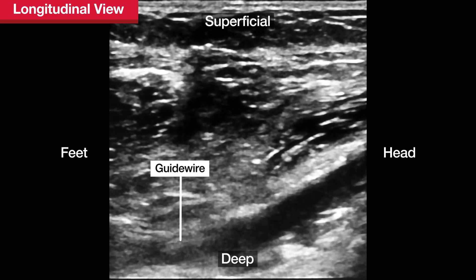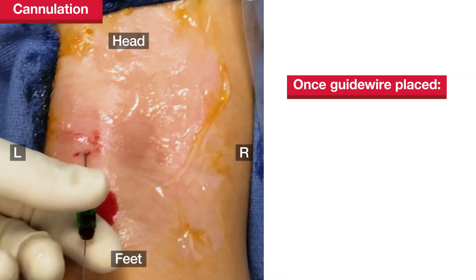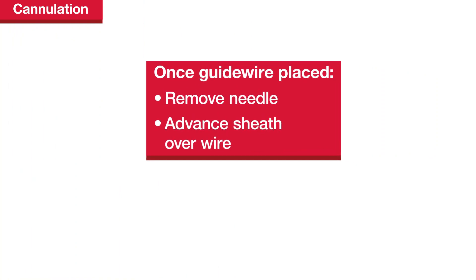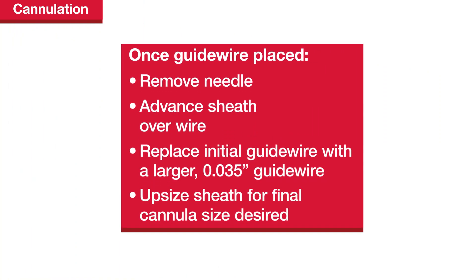The wire should move freely in the compressible vein. Once the guide wire is in place, remove the needle and advance the corresponding micropuncture sheath over the wire. A 4-French micropuncture sheath accepts an 0.035-inch guide wire, and the sheath can be upsized over this larger wire for the final cannula size desired.